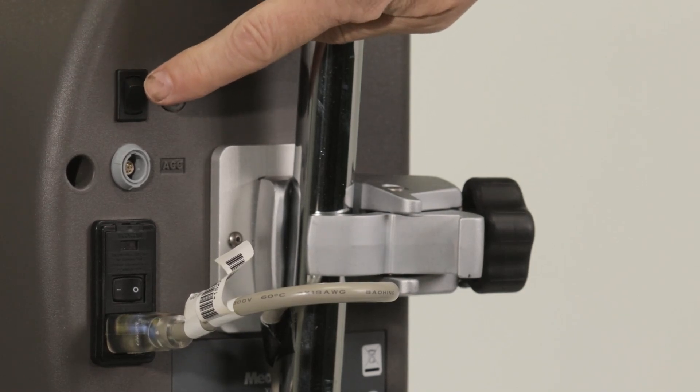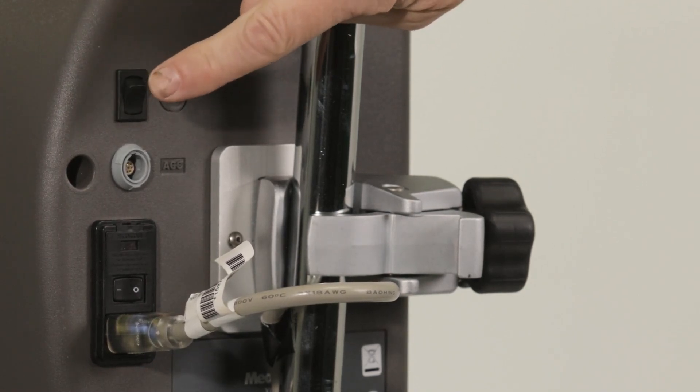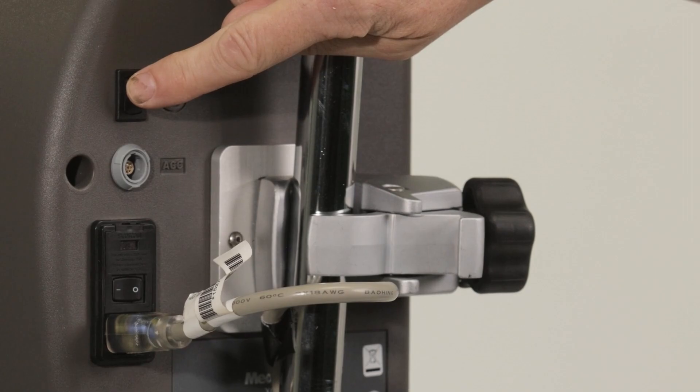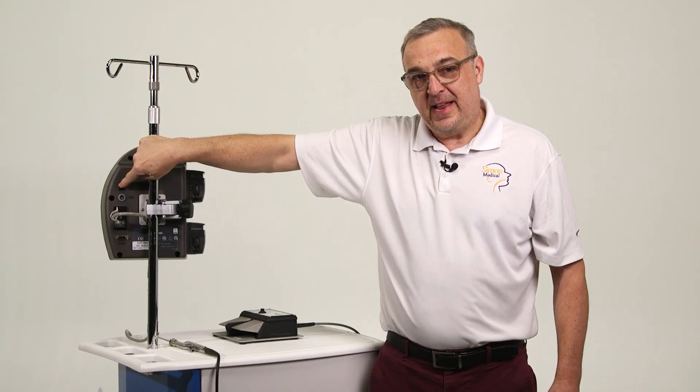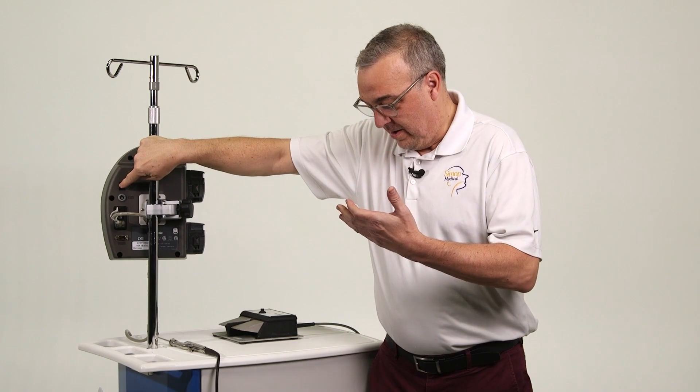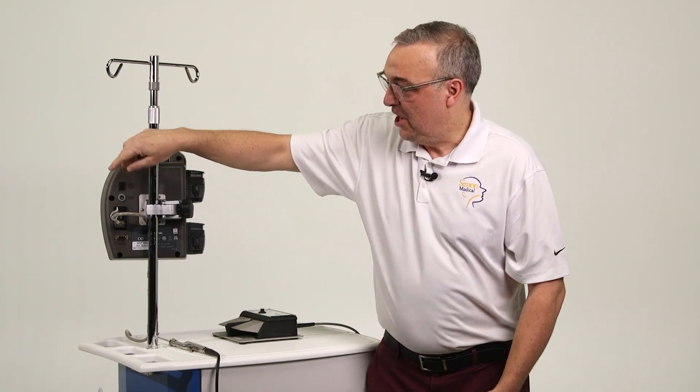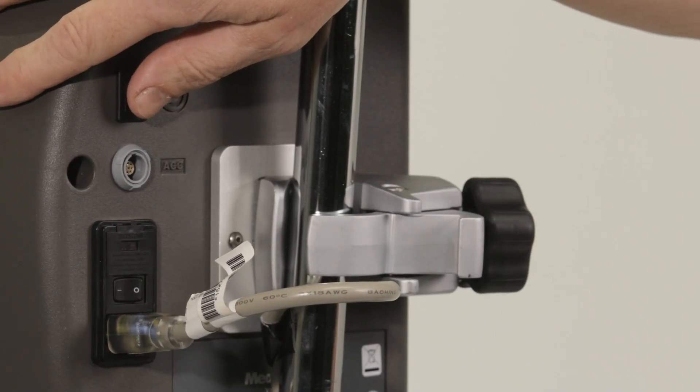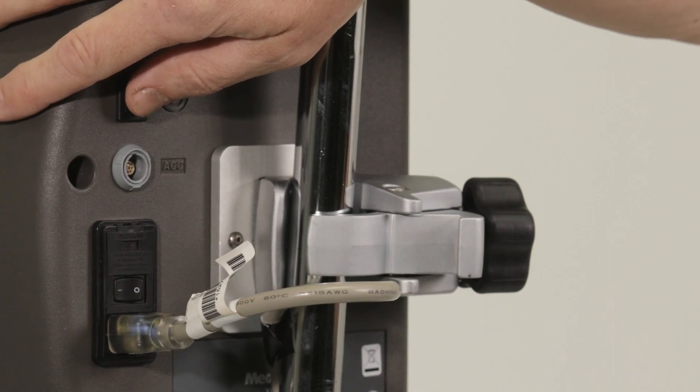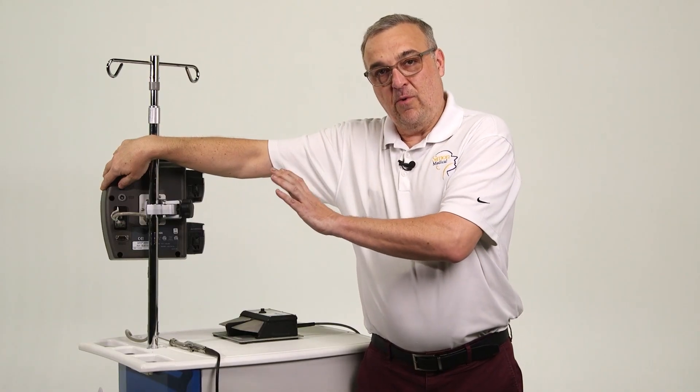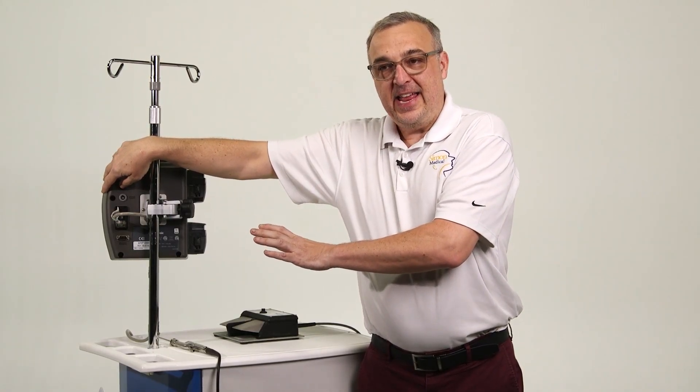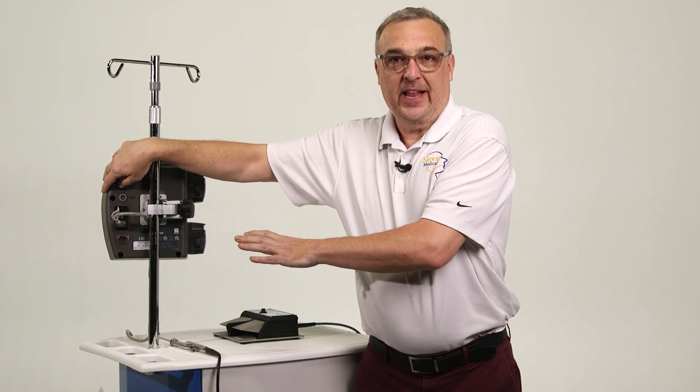This button up here, which is infrequently used, is actually an emergency backup for the foot pedal. If you're in a case and a foot pedal stops working or you don't have a foot pedal, you can manually control the microdebreeder or the Skeeter drill or the ENT hand pieces that you'll be utilizing with this.